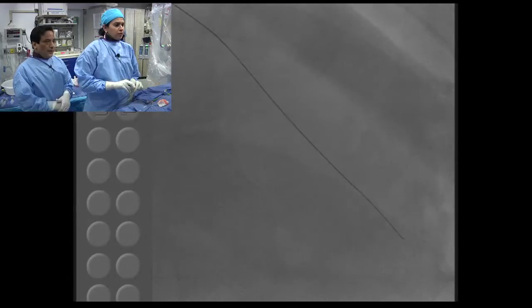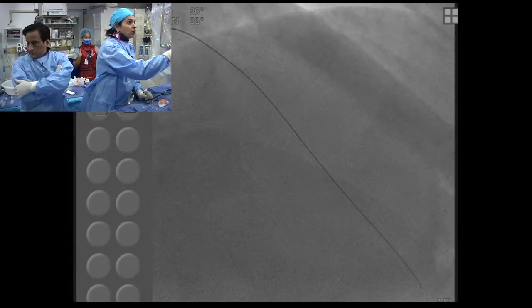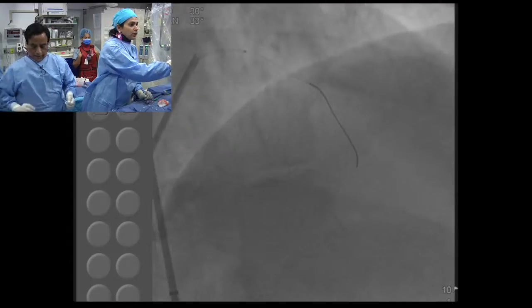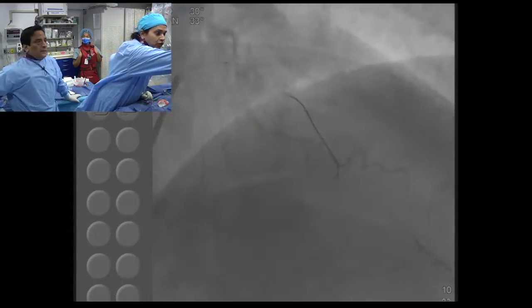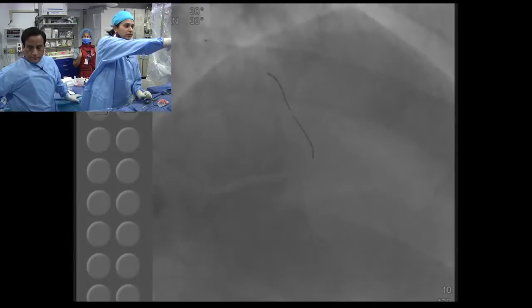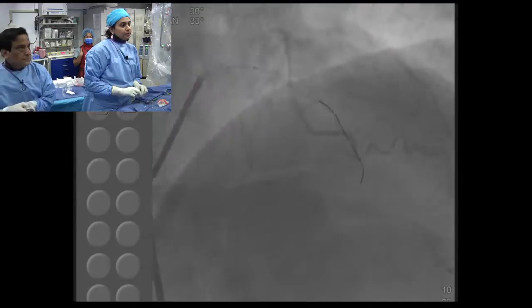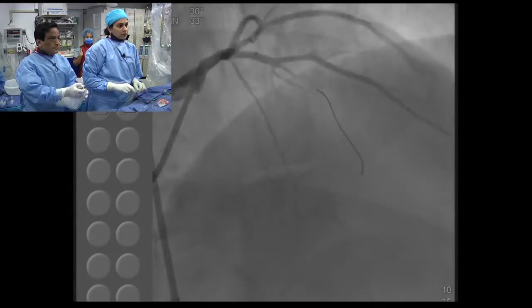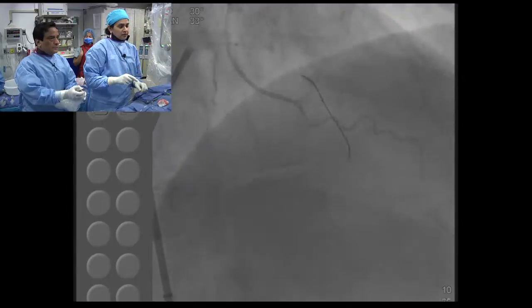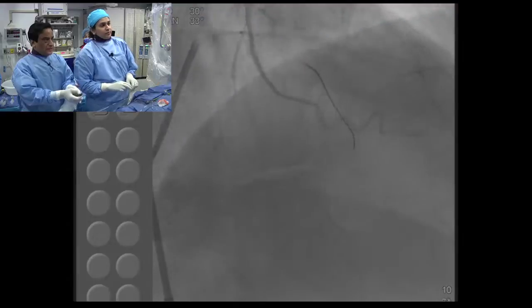Good. So tell us about what exactly was done. I went back and reoriented the wire, right from where the diag originates. If you can go back to the original. Did you give a different shape? No. Same shape, but oriented differently. If you see here, our wire was taking us in a southward direction. Essentially, it had to face up, right at where you can put a pointer there. Look down. Can you see it? No, we can't see it. Yeah, but that's okay. I understood that, just after the septal, you change the direction.